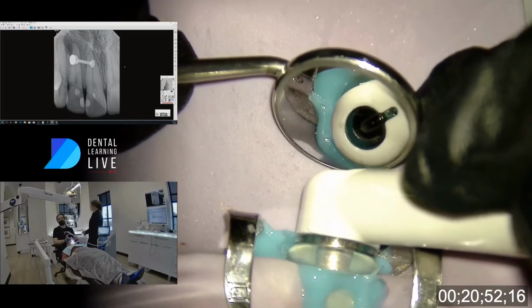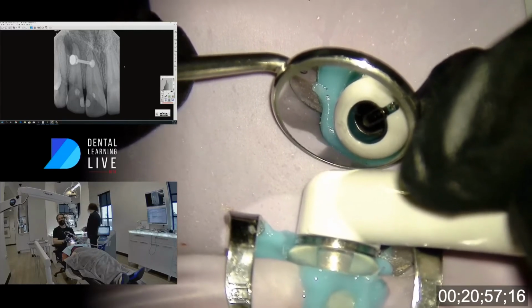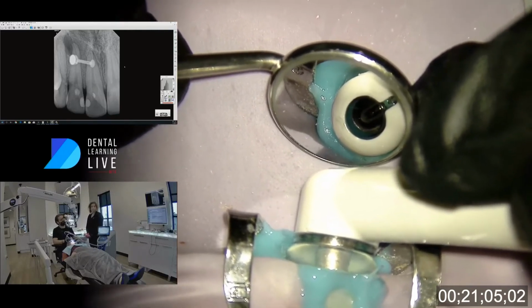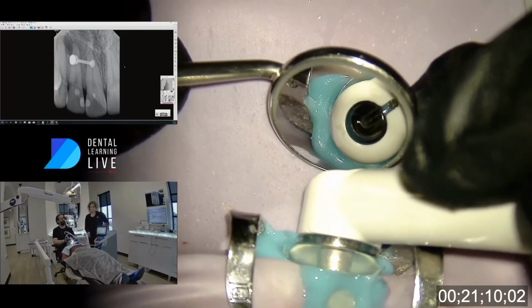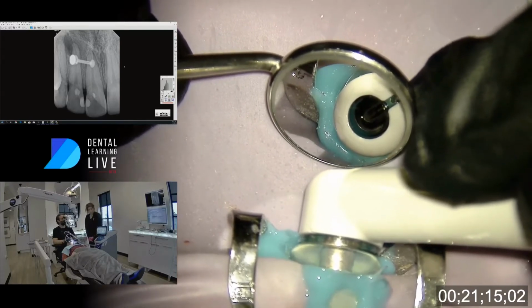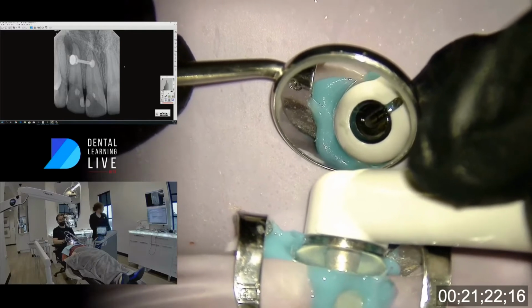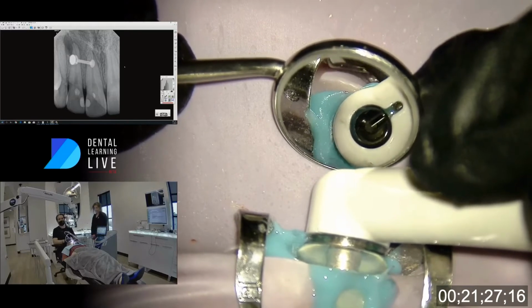And as long as that's right on top of that canal, the mechanism of action is actually working in this handpiece. And what it's doing is, as it pulls out all the fluid, which is almost done. Where are we at, Lindsay, on the percentage? Okay, we've just initiated the procedure. So degassing's done. This is going to run for 5 minutes. And the console is going to calibrate the sodium hypochlorite that's inside, and it's going to hum right around 3%. My job is to make sure there's no leaks and to make sure that dancing bubble is just right on top of that canal.